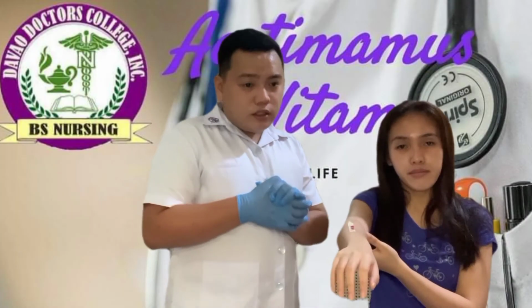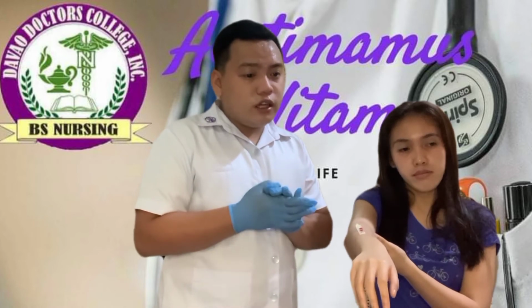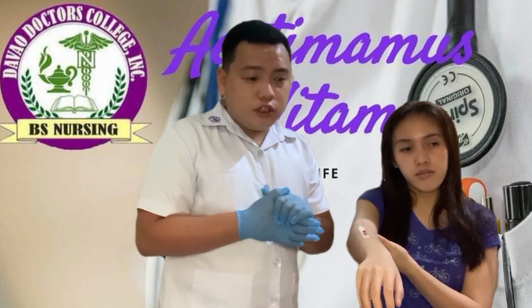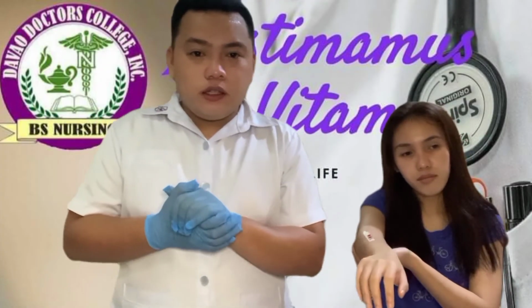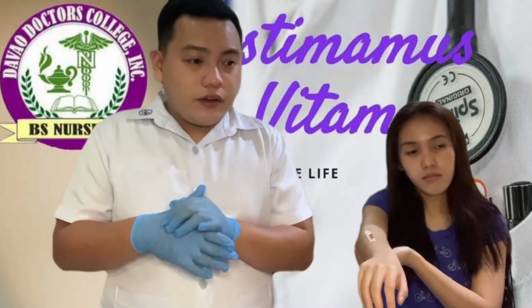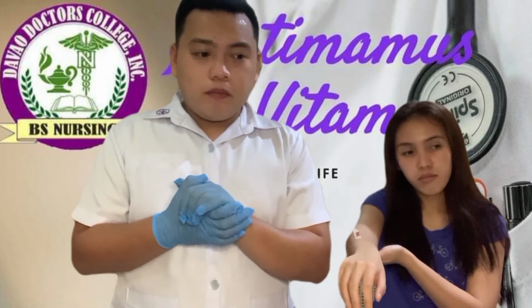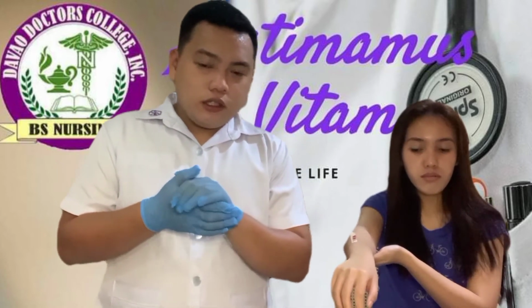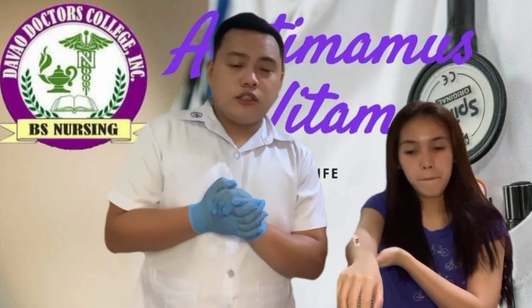So the rationale for this is to ensure that adequate perfusion still reaches the affected extremities. So for the next step, you need to place an appropriately sized rigid splint, for example our padded board, under the injured body part. Rationale for this is in order to support the injury and prevent further damage.